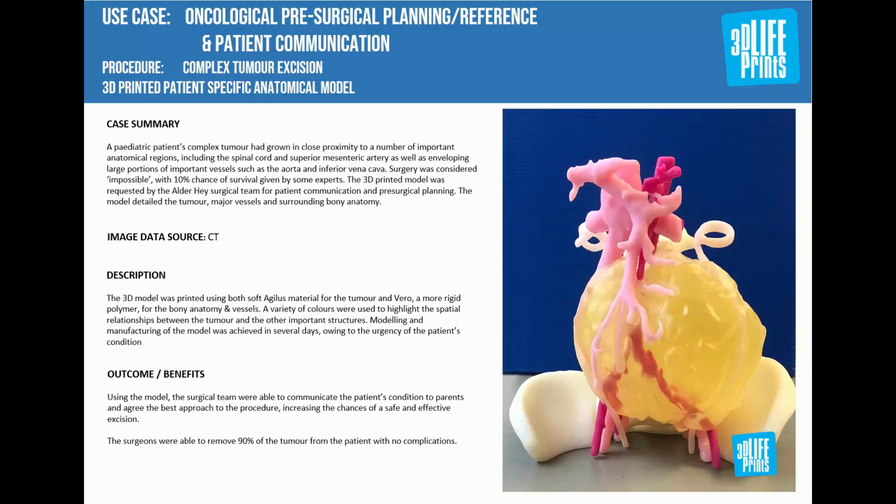So I'd love to share this case because it's just such a beautiful example about how great CT patient images were used to create a patient-specific model, which, in addition to the imaging reference and all the other tools that the surgical team have at their disposal, was used to help plan this surgery, practice this surgery, and ultimately result in a successful outcome.